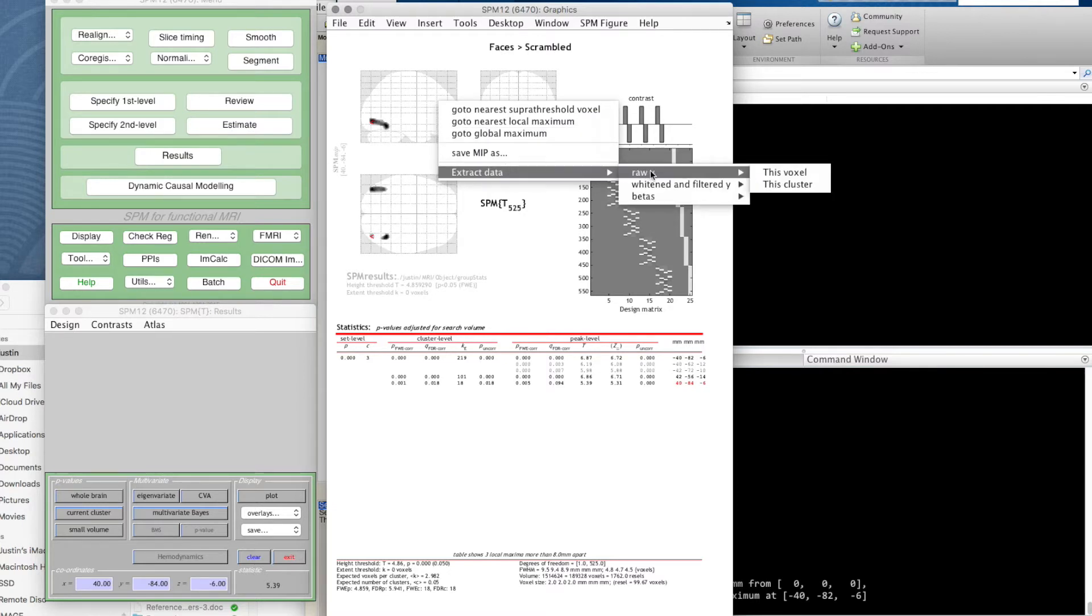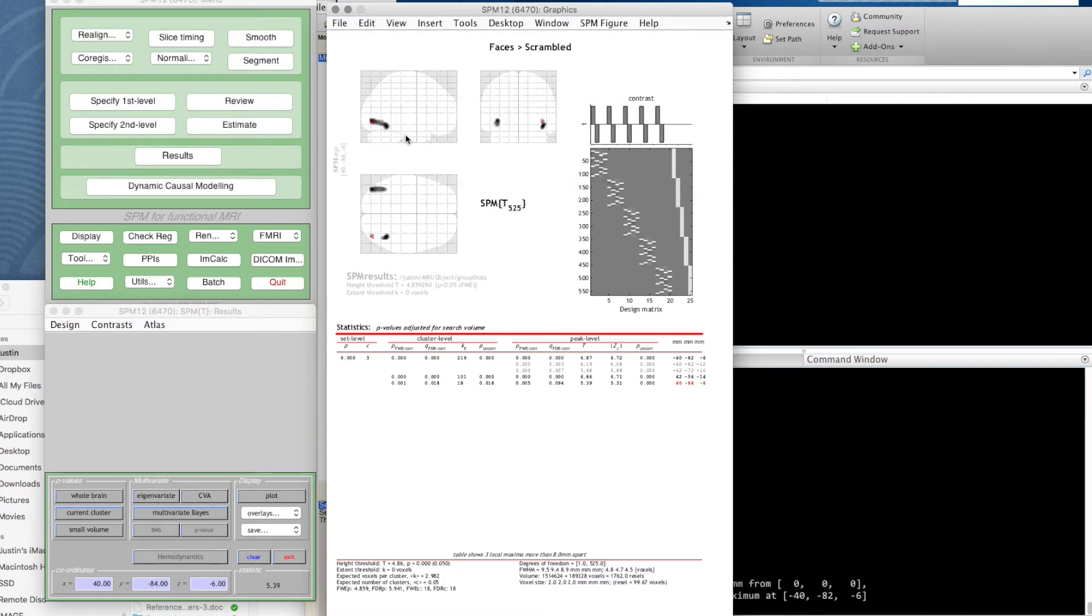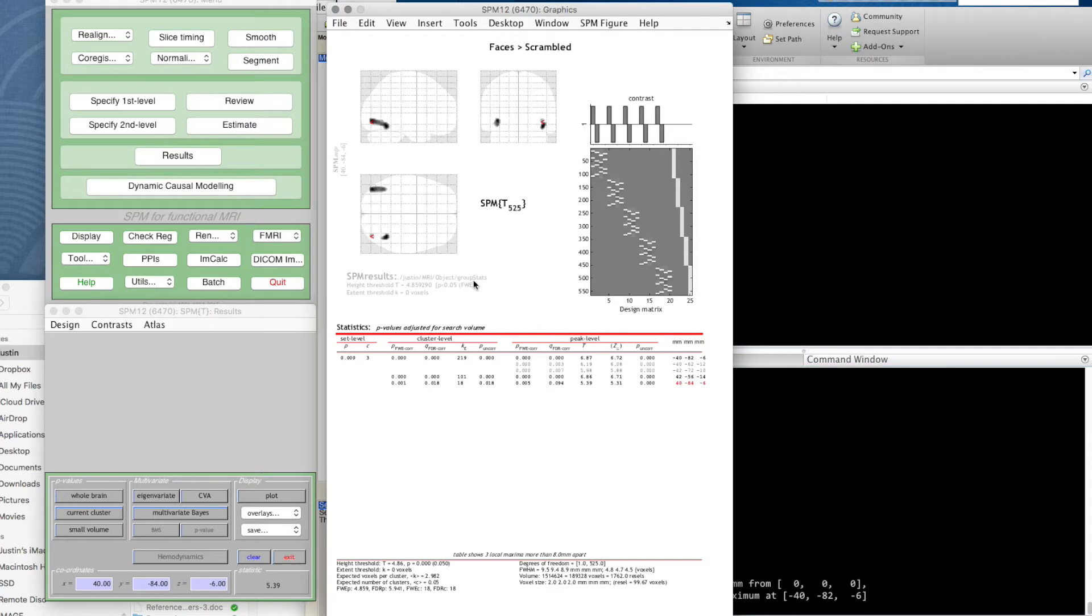We have here the coordinate where we're at. This is a little summary telling us what we've got. The SPM is in the group stats directory which we made. It says height threshold T equals 4.86 or something like that.